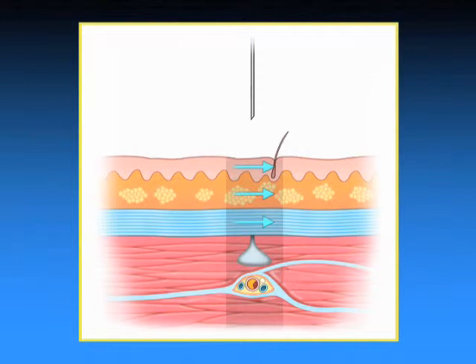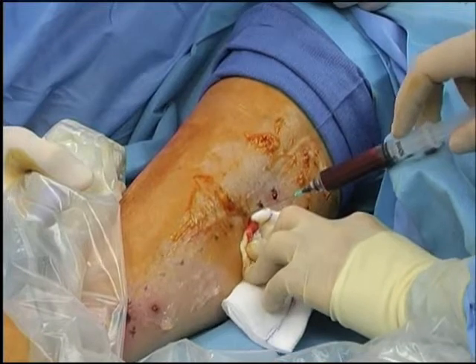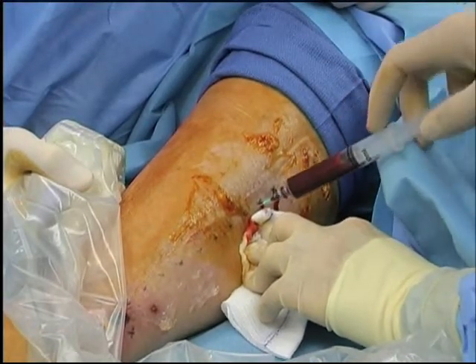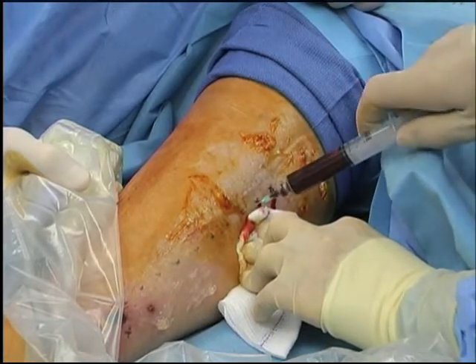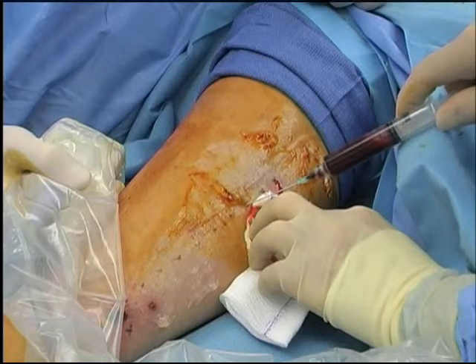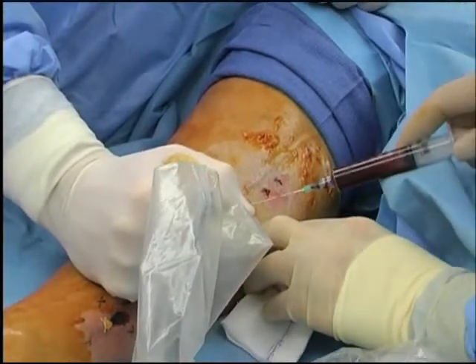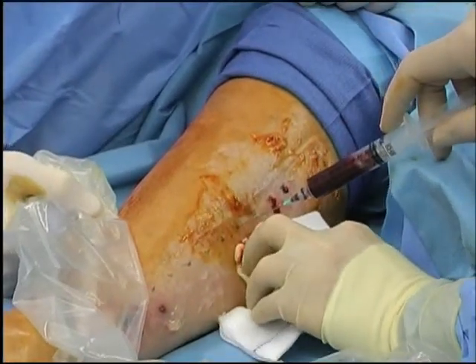The needle track is now broken at the junction of each tissue layer, trapping the injectate in the muscle. While inserting the needle, draw back 0.5 to 1.0 milliliters on the syringe to prevent intravascular injection. Injections are ideally placed within 1 centimeter of the targeted vascular bed. Ultrasound guidance is used to localize injections.